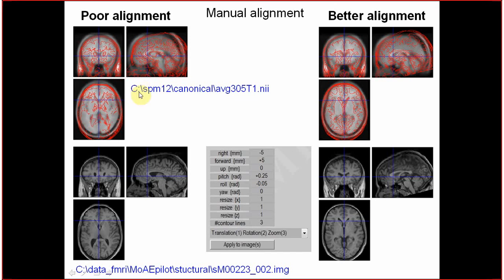First of all, you have to open both images using the Check Reg button. I will show you how to create those nice contours projecting one image onto the other. This is the initial view you need to get, and this is the resulting view where you can see that the alignment of the canonical image and your individual sample is still not perfect because the shape is not the same — but it is already better than what we had before.